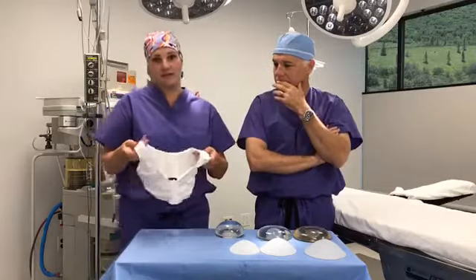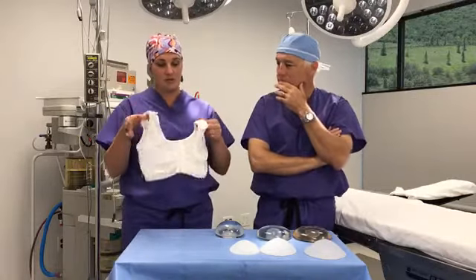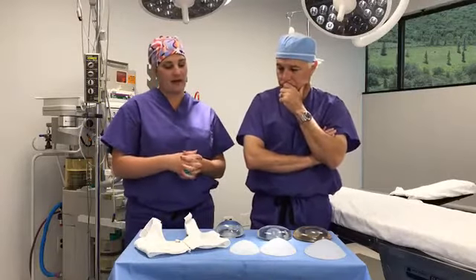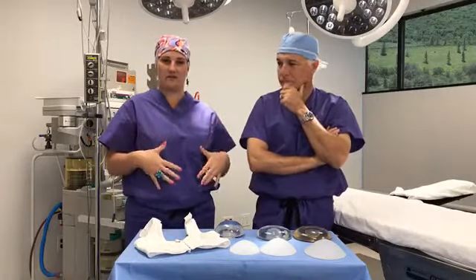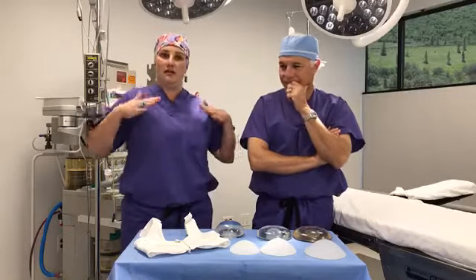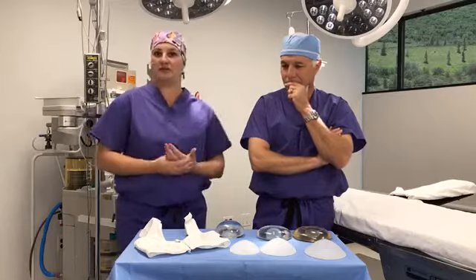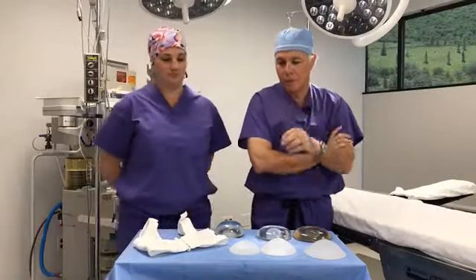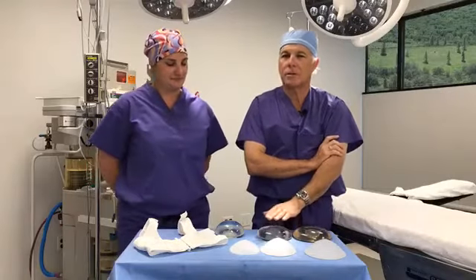Yes, if you would like. I feel like most women just trying on the bra get an idea of what it'll look like. I've had a few patients want to put on a tank top to get a better feel, and I had one patient bring in a bathing suit, and we slipped the sizers into her bathing suit instead of the bra.